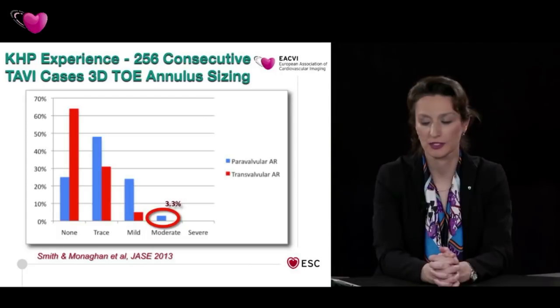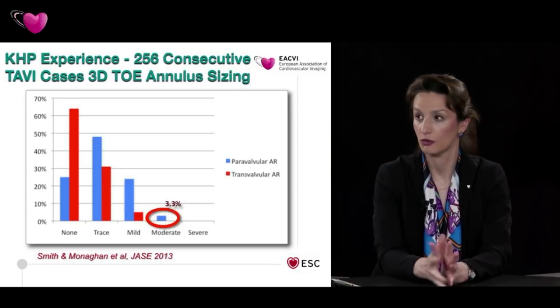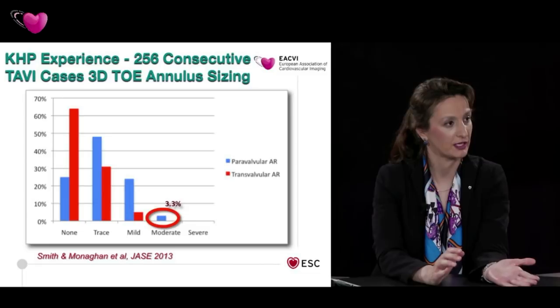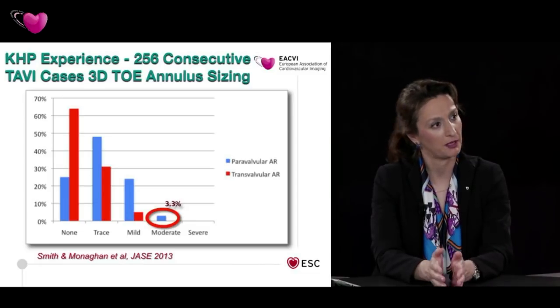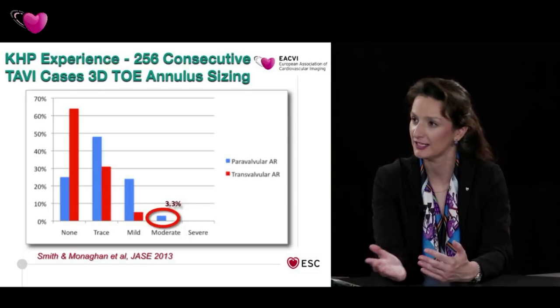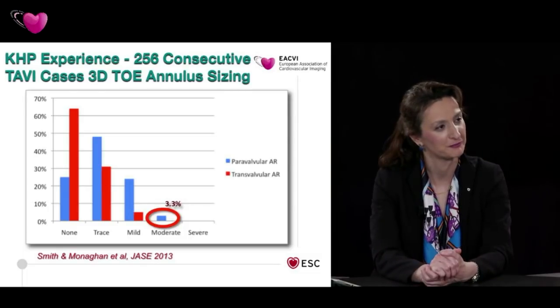Exactly. We have one question from the audience as well. You presented a case on tricuspid aortic valve, but in bicuspid aortic valve, sometimes it's difficult to measure the aortic annulus. Any tips or tricks for you?